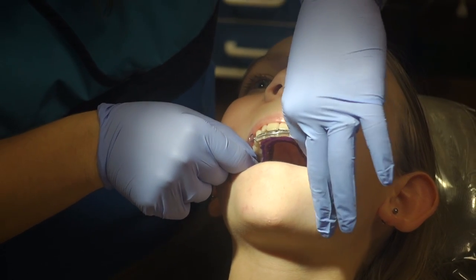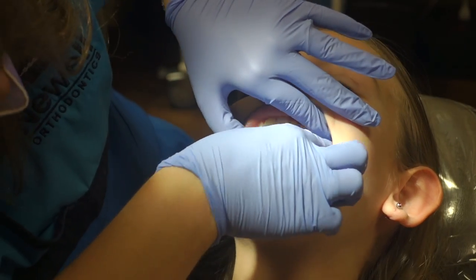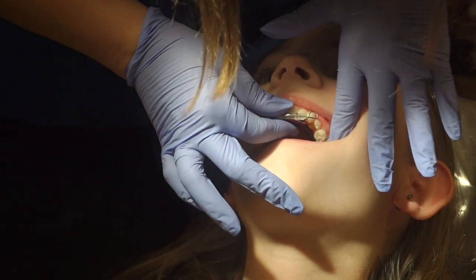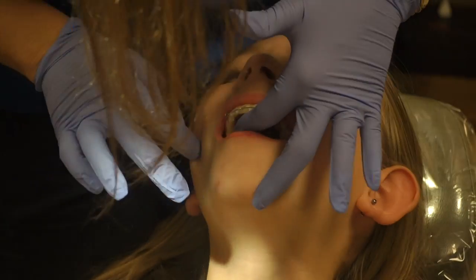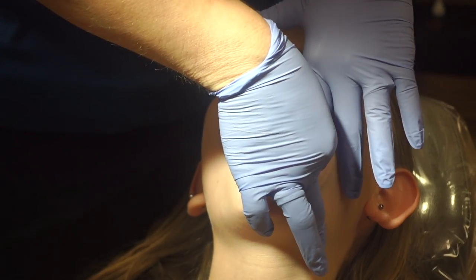Just from maybe the new teeth growing in? Right. Because this cut out — not just for those? And these are the same four teeth — she had permanent teeth when we made it. That's why we made this design. So she should be able to wear it the whole time as the rest of her baby teeth come out, as the permanent teeth come in.